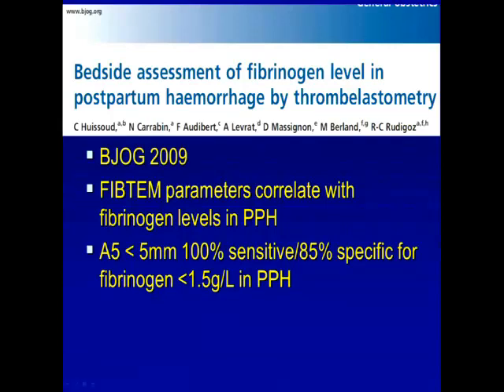And I think the problem is a lot of times on the wards, you see someone with an abnormal INR and you automatically end up, like a lot of people, transfusing them FFP, and that isn't modern transfusion practice. At least with the ROTEM, you can reassure some of these people that the clotting coagulation cascade is totally normal. You don't need to give FFP, and you can save the $1,000 worth of FFP and the potential morbidity of transfusing a blood product that isn't required.